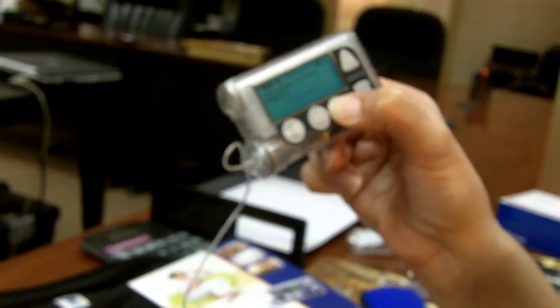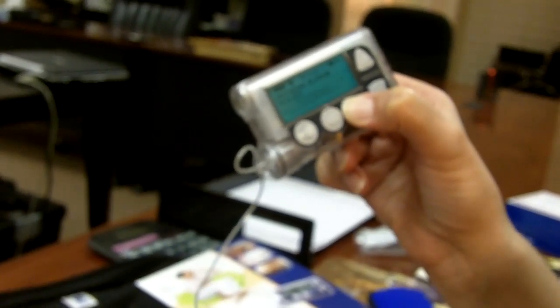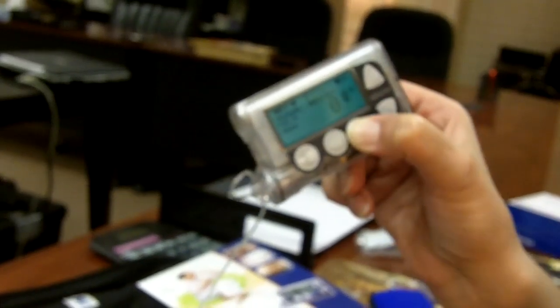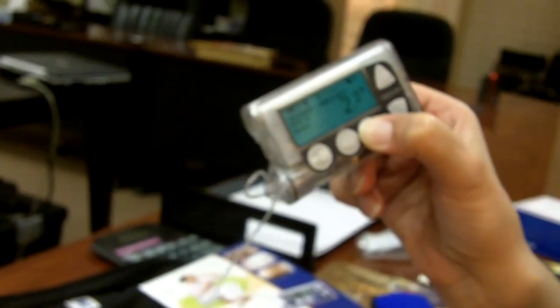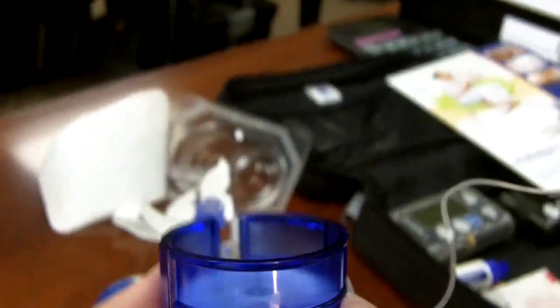I'm going to hold the ACT button down to prime, just keeping my finger on the ACT button. Right now the piston is moving up to the reservoir, and I'll know when it hits the reservoir because it'll start to push units through. Now I'm just going to look and wait until I see drops of insulin — and there we go. So now this is ready to be inserted.